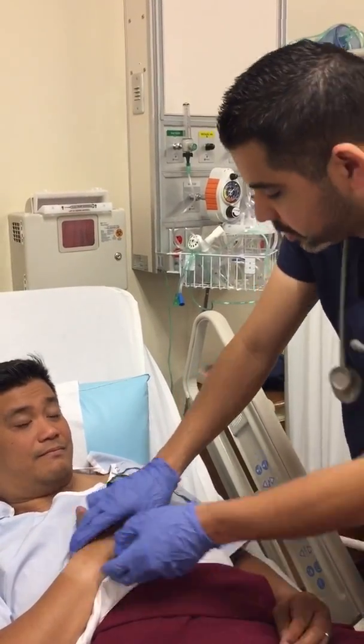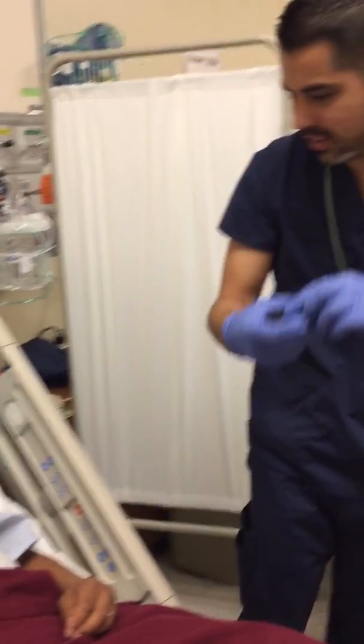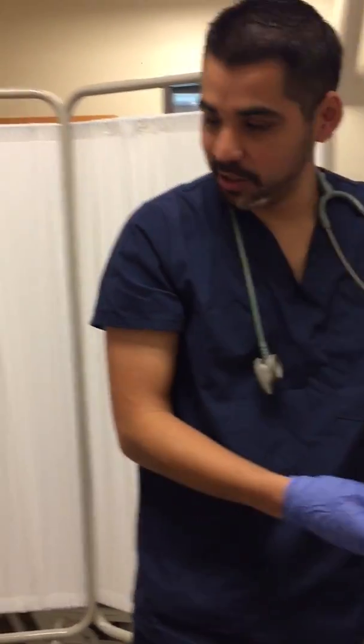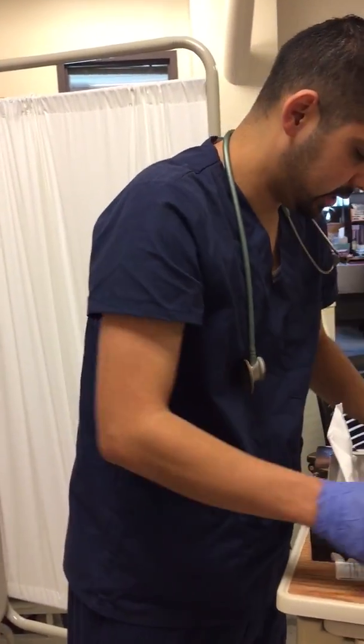Okay, thank you very much, Richard. And we're gonna be taking this off now, okay? You probably didn't like that little guy, huh? It's just doing its job. It's just measuring the oxygen in your blood. People always freak out on these things. It doesn't do any harm.